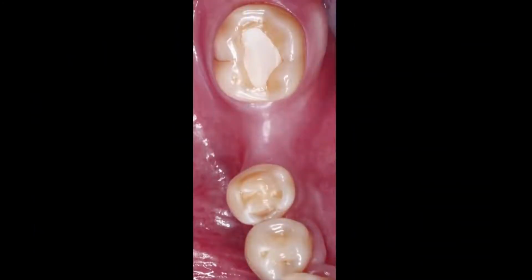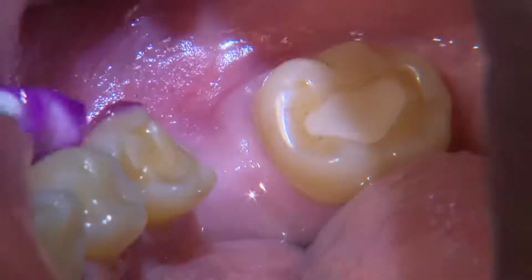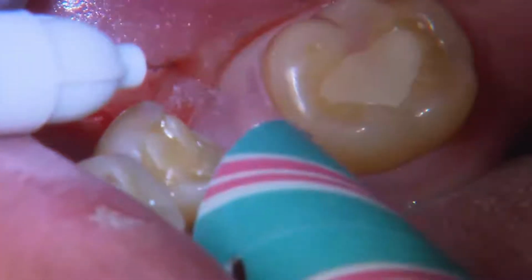And I want to present this case to the practitioners again that want to incorporate implant dentistry into their practice. Obviously, I've done this in the past where I've presented cases that are ideal. In this situation, the patient is missing tooth number 30.